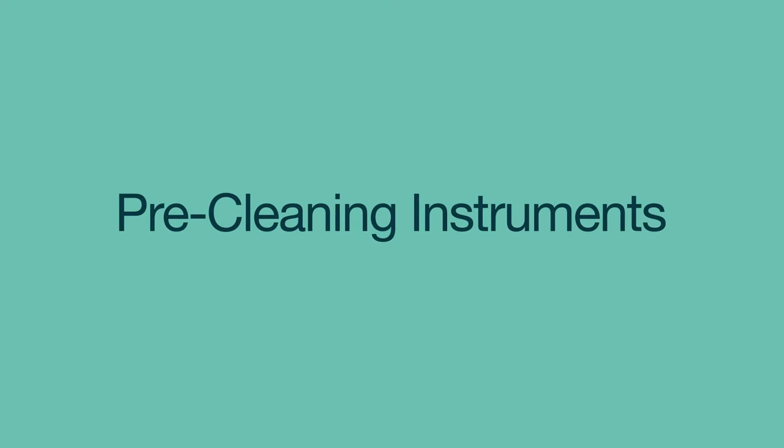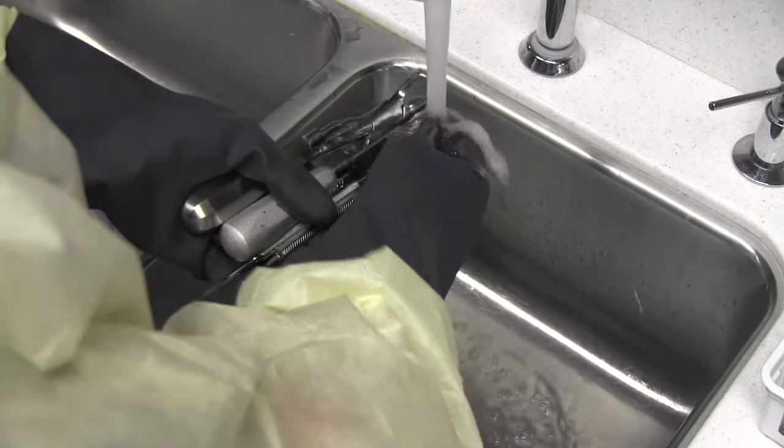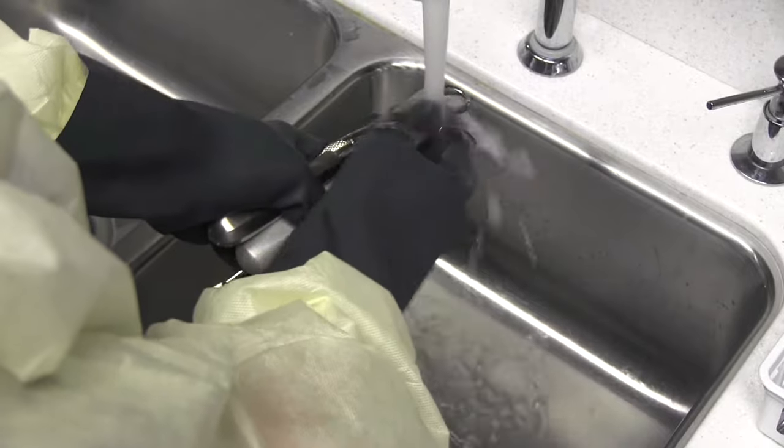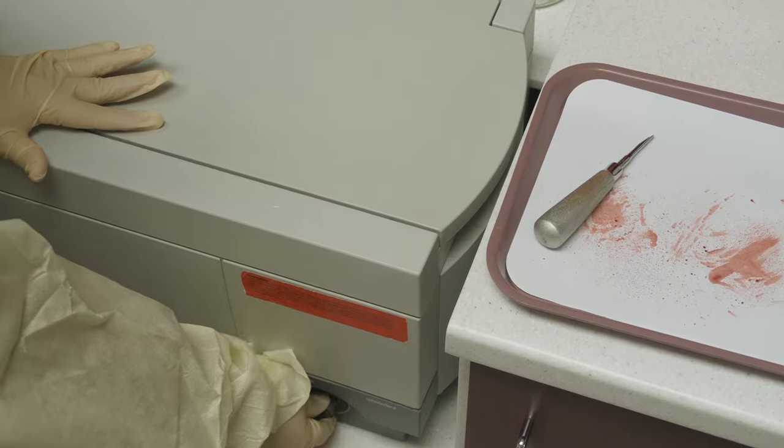It's important to pre-clean instruments before they're sterilized. Start by rinsing the instruments under running water to remove any large debris. Place all instruments except the handpieces in the ultrasonic cleaner and turn it on.